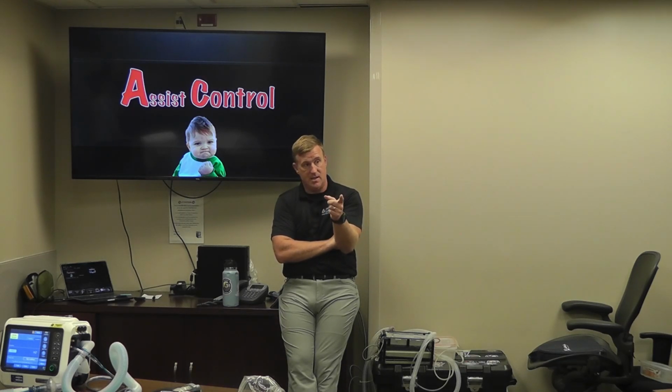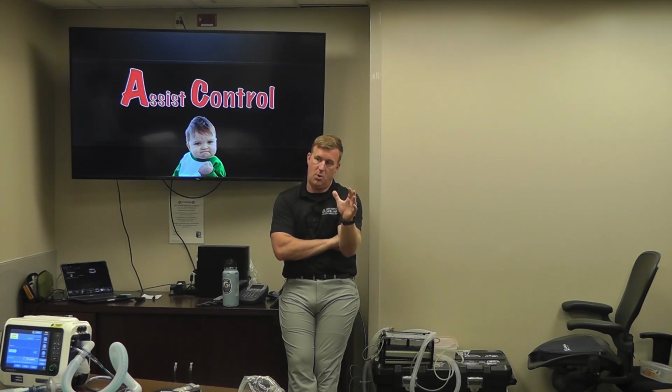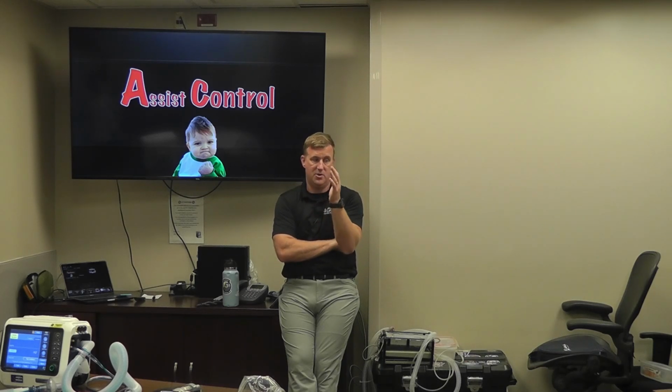So AC, exactly like he said, whether it's a machine-initiated or patient-initiated breath, it's the same breath. So if I say I want a 500 cc tidal volume breath, and I say I want a rate of 12, for 12 breaths, it's going to be 500 cc's. The patient triggers a 13th, 14th, 45th breath, it's a 500 cc breath. So same breath, whether it's machine-initiated or patient-initiated.